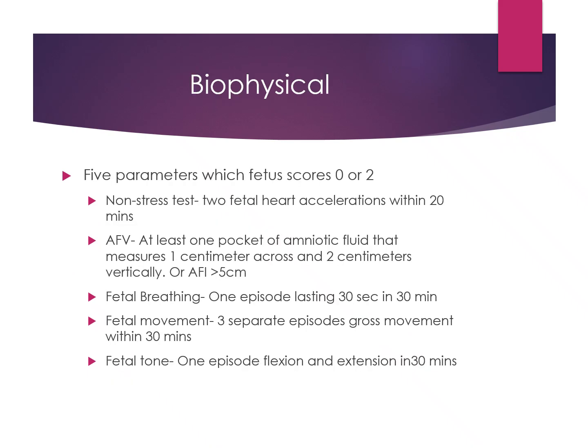Now, AFI or AFV is a part of the next topic we're going to talk about, which is the biophysical profile. So the biophysical profile is a really good test to check for fetal hypoxia, or a lack of oxygen getting to the baby. If we are doing a biophysical profile, it's usually for mom not feeling kicks, or no movement from the baby, or mom's having some abdominal pain, or she's past due dates. If she's getting closer to her due date, so she's 39 weeks, they're going to be doing them quite frequently.